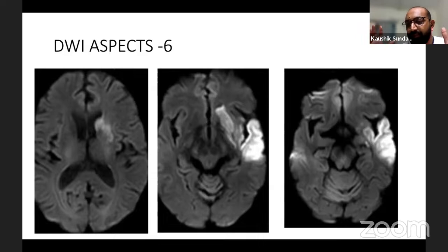So if there is a carotid calcification, again, it tells you that it is chronic. But is there anything that helps you differentiate a stenotic segment that got occluded from a chronic total occlusion? Are you able to understand what I'm trying to tell? A 95% stenosis patient where you had an occlusion, or a chronic total occlusion, and then the patient has had another stroke. This is very important. Think about it now, Dr.